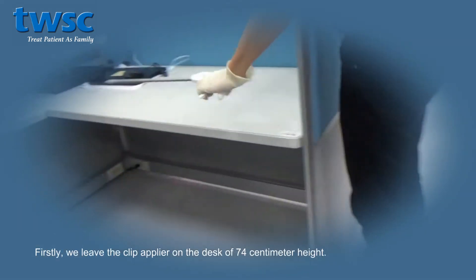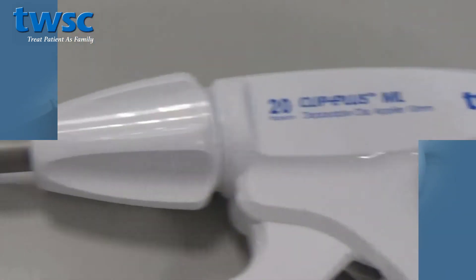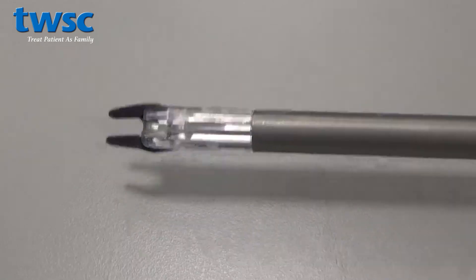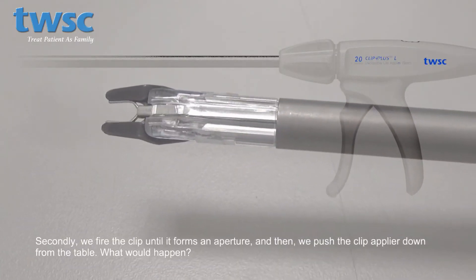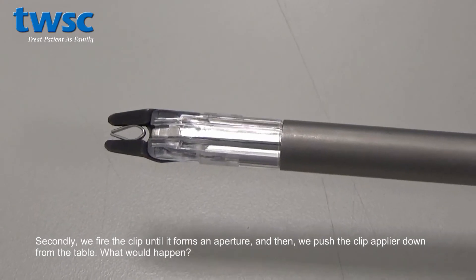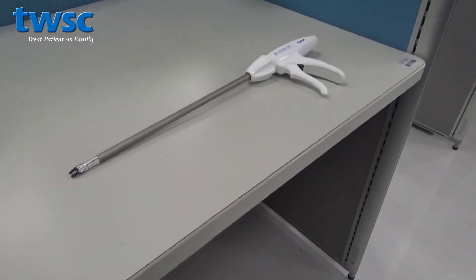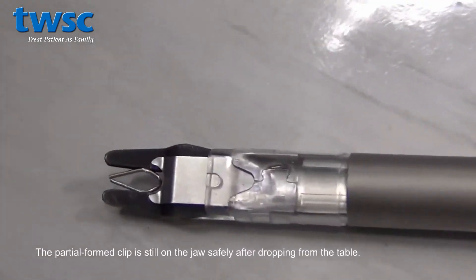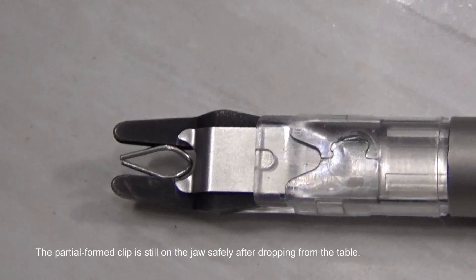Firstly, we leave the clip applier on a desk at 74 centimeter height. Secondly, we fire the clip until it forms an aperture, and then push the clip applier down from the table. Result: the partial formed clip is still on the jaw safely after dropping from the table.